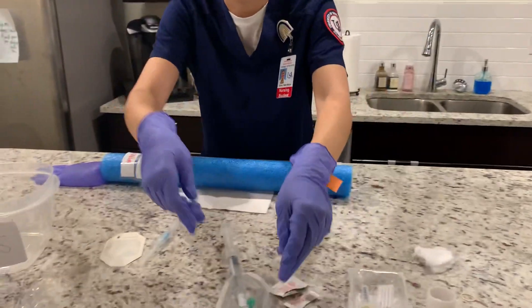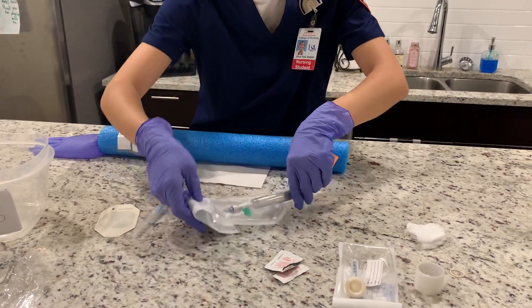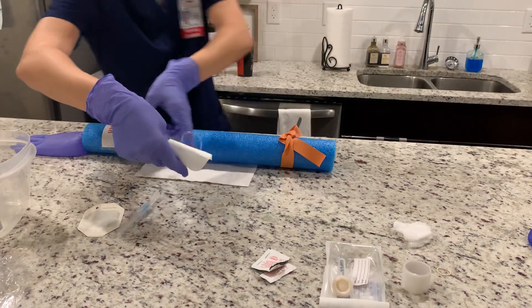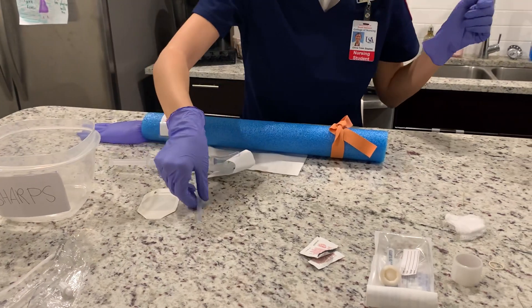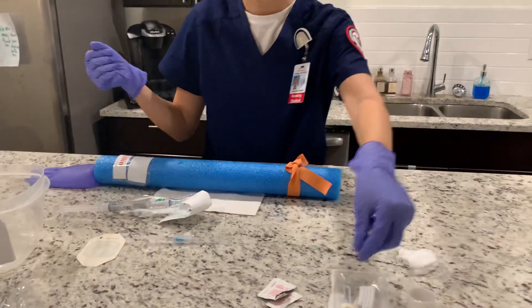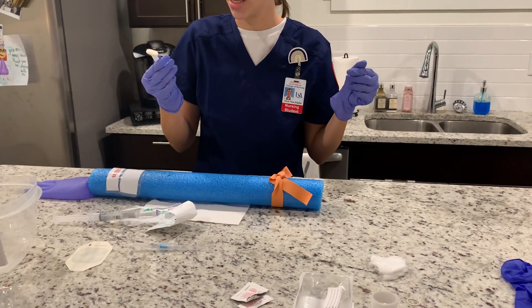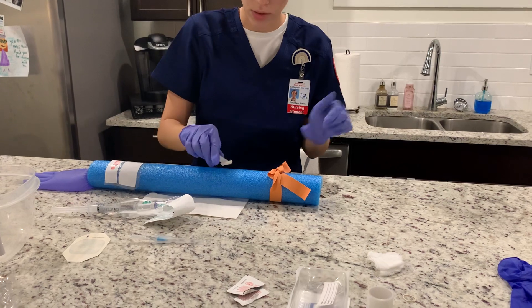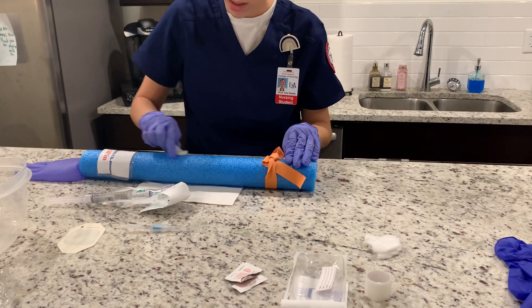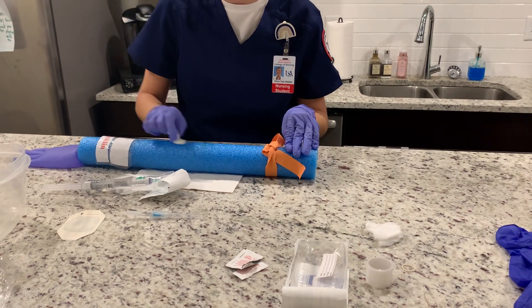Now I'm going to move what I need closer to the patient and begin cleaning. I'm going to take the chlorhexidine, push in the wings to activate it, and clean using horizontal, vertical, and circular motions for 30 seconds.